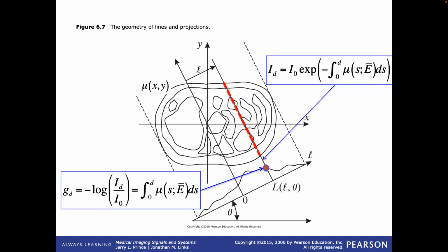And so in the morning, basically what happens is every day they turn the X-ray tube on, warm it up because you need to get it warm and everything like that. And then they step through different mAs, different intensities, and they step through different energies and they calibrate the whole thing. So that now when I push the button and say I want 120 kVp, 400 mA, I know what this is. What I know it is.